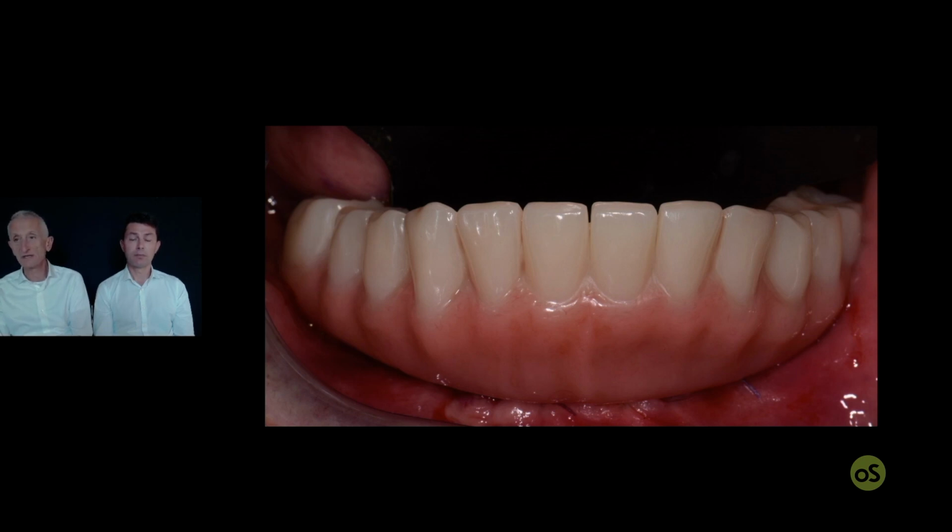And imagine also for countries where the patient has not a huge budget, a simple well-done framework and a digital denture shell make a monolithic restoration quite stronger and quite durable. In the long term, I'm talking about tens of years. So it is really something interesting that we are looking forward to seeing how this will develop in the next time and months.